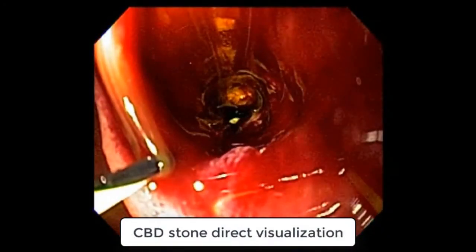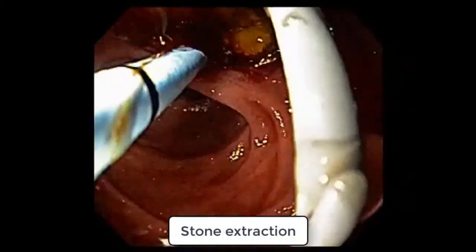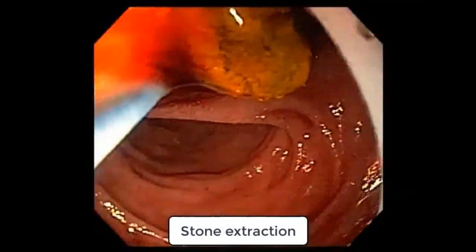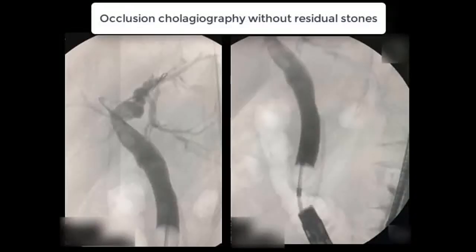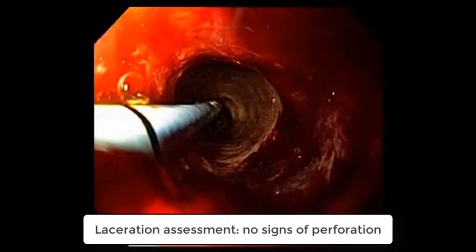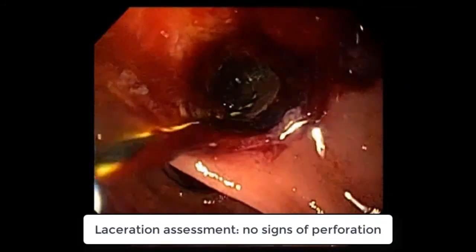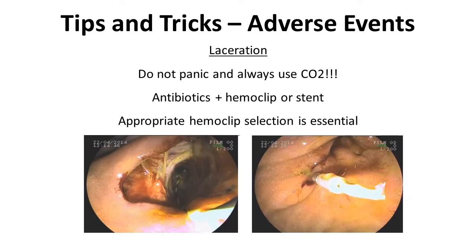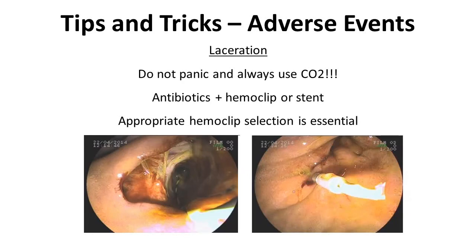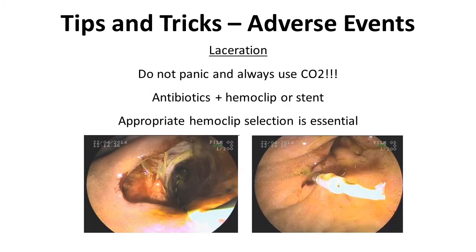The CBD stone was visualized and successfully extracted by balloon sweeping of the bile duct. The occlusion cholangiogram showed no residual stone or contrast extravasation. Finally, despite laceration, endoscopic evaluation showed no signs of perforation or active bleeding. In cases of laceration, hemoclip or stent placement associated with antibiotics may be used to avoid late adverse events.